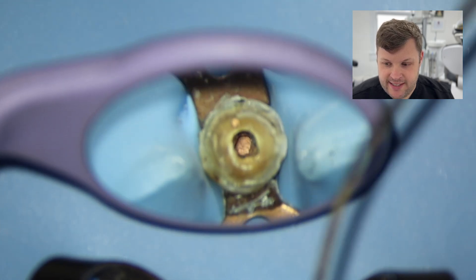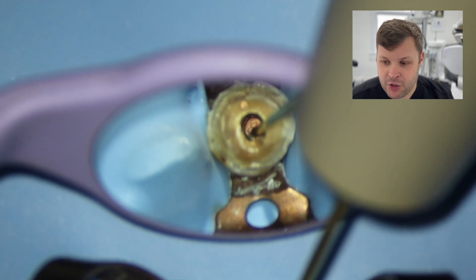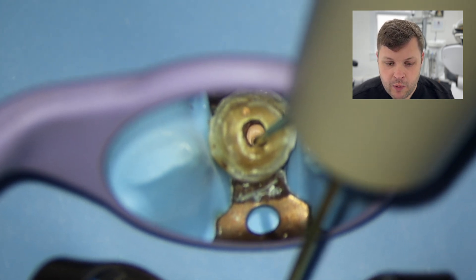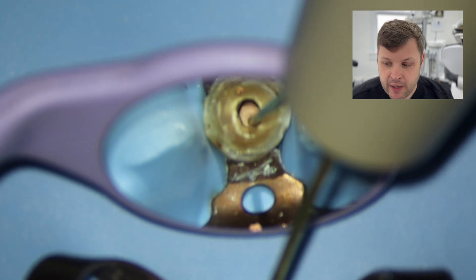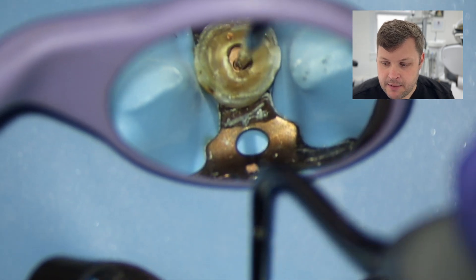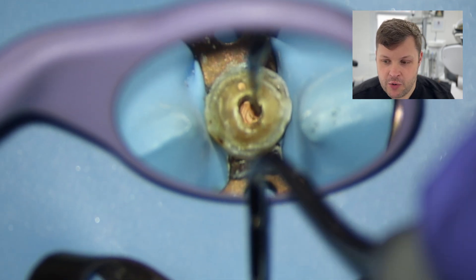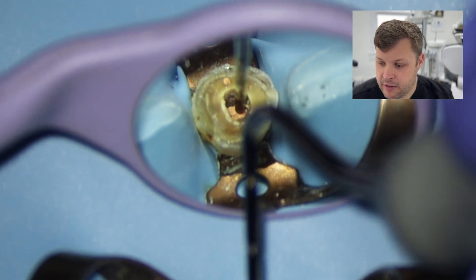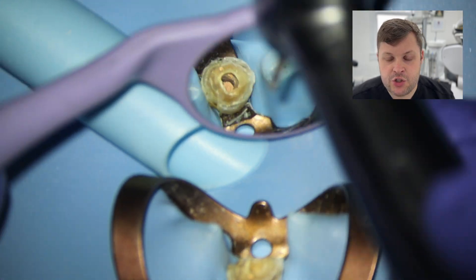Once the GP is nicely condensed at the end, I'm using the B&L backfill unit. I can see the GP all the way to the end. I've decided to backfill all the way in one go — sometimes I like to backfill a little, push it down, backfill again — but here I know I'm going to get a nice monoblock of GP.